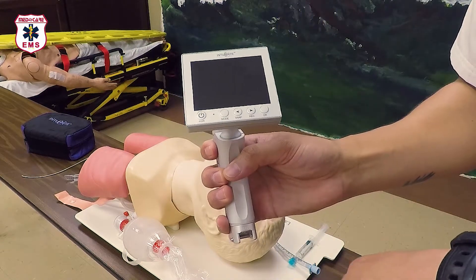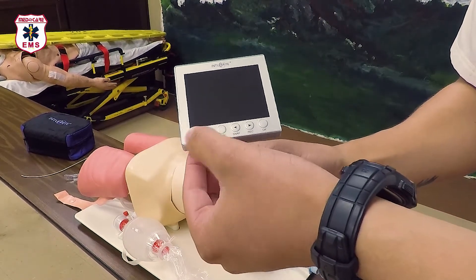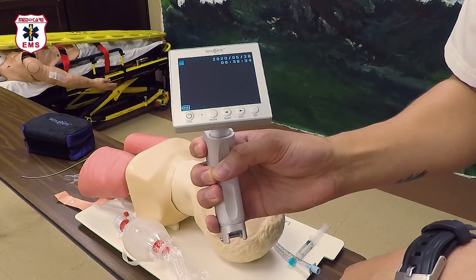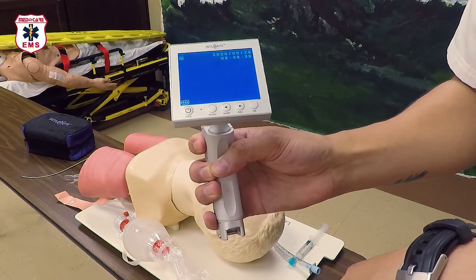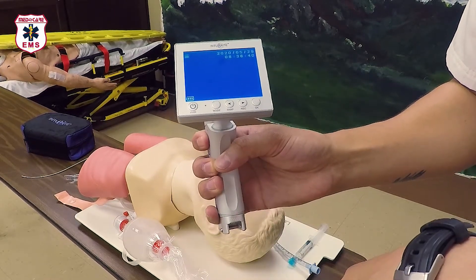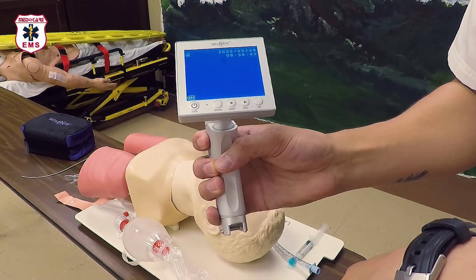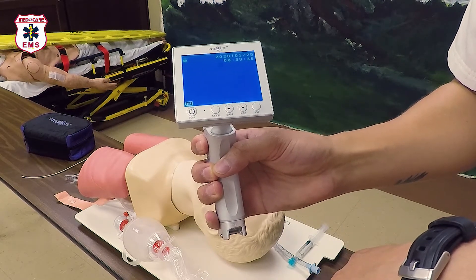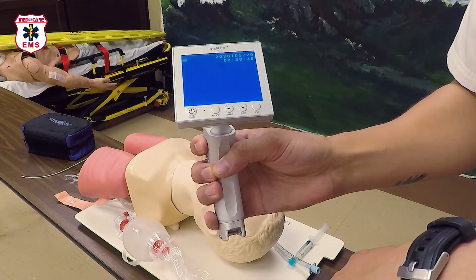At the beginning of your shift, begin by powering on the screen with the large power button on the bottom left. Once it goes through its initial checks you'll see the screen. At the bottom left of the screen is the battery indicator — if it's less than 50%, go ahead and get a fresh battery or begin recharging. At the top left is the SD card indicator; without an SD card you cannot record pictures or video.